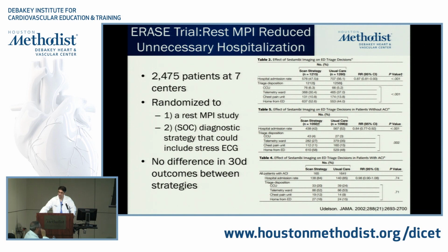So in those patients who didn't get admitted, who did not have acute coronary syndromes, rest myocardial perfusion imaging led to much more confidence in the physician in sending the patient home, with no change in outcomes compared to standard of care. So this is one test that you have at your disposal, but the caveat is they have to be having active symptoms, or be within a very close period of time to when their symptoms abated. Generally, I would say 10, 15 minutes. After that, I'm not sure. You start losing sensitivity the longer you wait if they're asymptomatic.